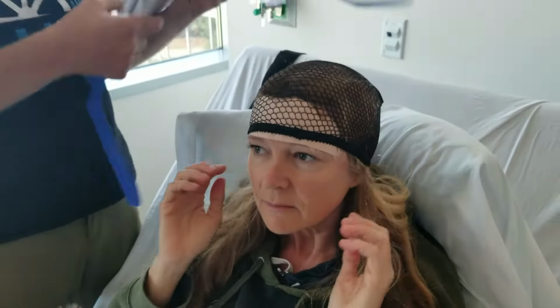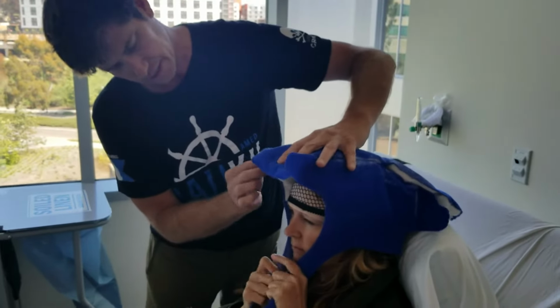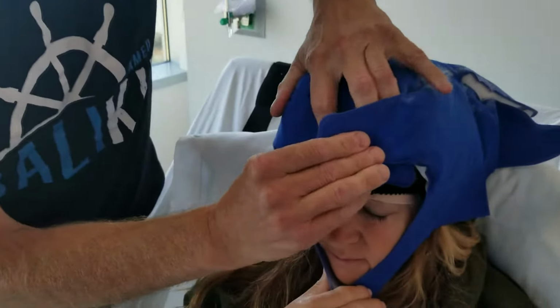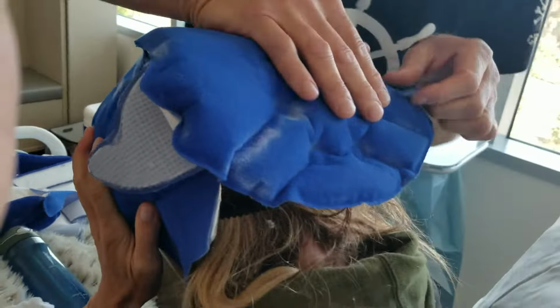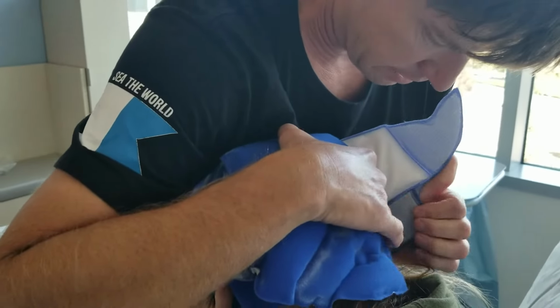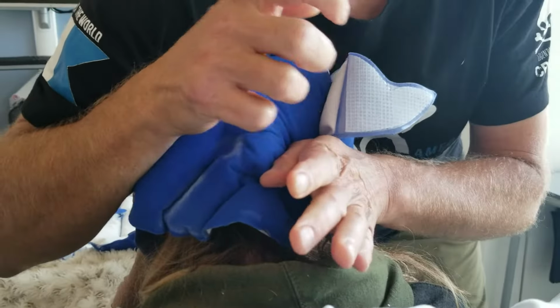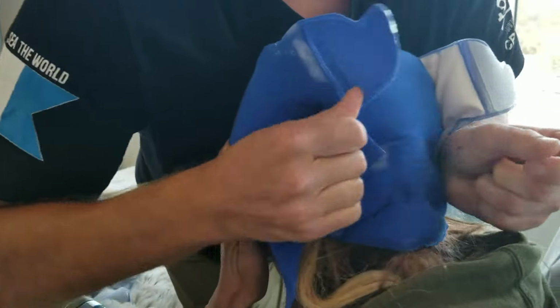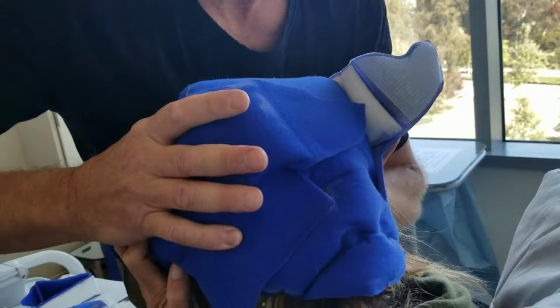I don't want to take too much time, because the whole thing is to keep your head cool. She holds this down, so she's not even attaching it, and I just attach the front. Then I come from behind, and this is where I get up on the bed just to give myself a little height, so you're not jamming their head around. I'll squeeze that in because you want it to be close to the neck, and then I'll do that bottom one. Then I'll come over here, same thing, squeeze that in and do the other bottom one. Now the 2 bottom ones are connected, and then I just use pressure and push that one over, and use pressure and push that one over. So now the cold cap is on.